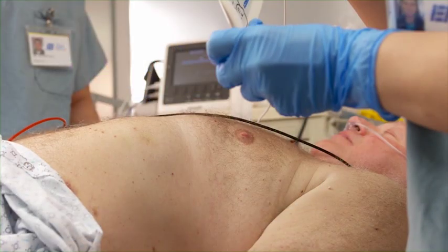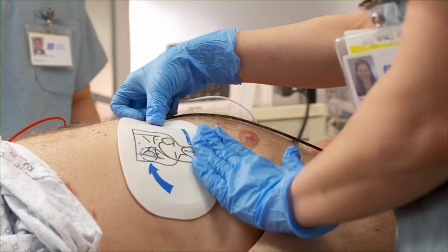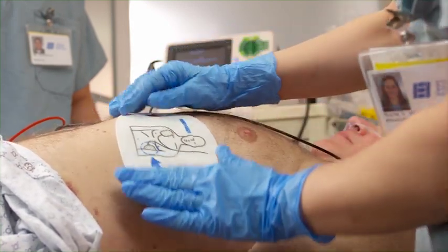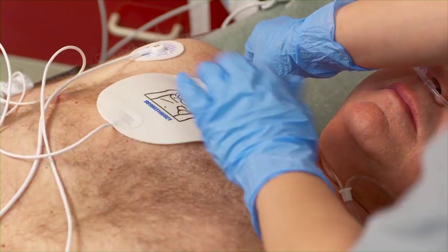In this case, we'll assume we have prepared for both monitoring and synchronized cardioversion using the multifunction electrode pads, and have a clear signal and large QRS complex.